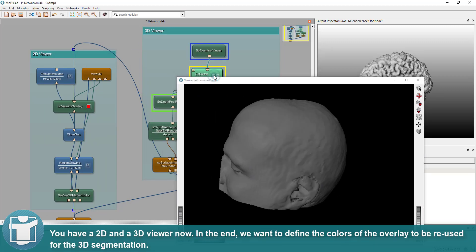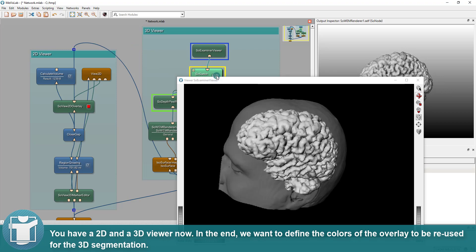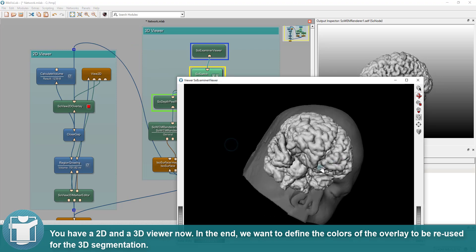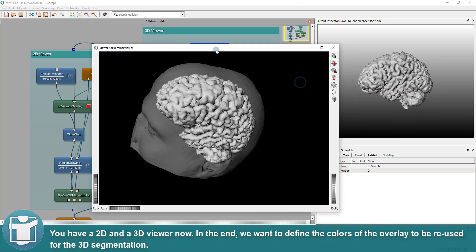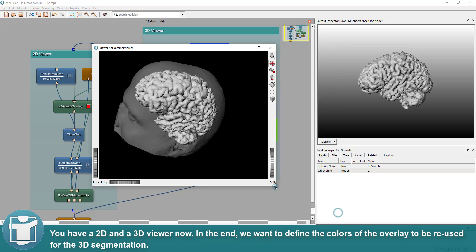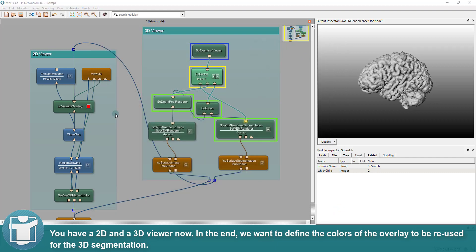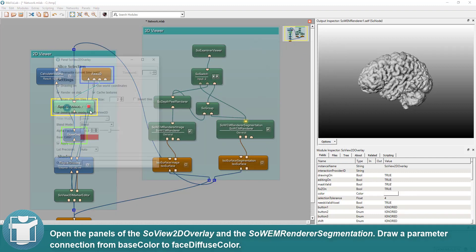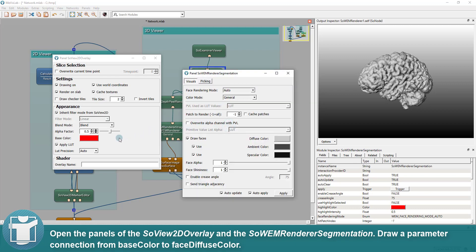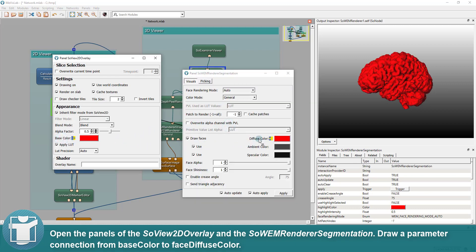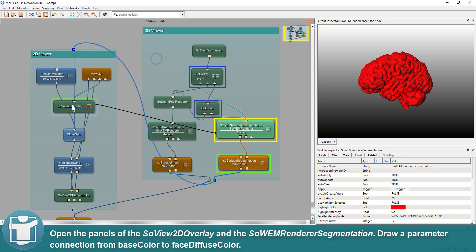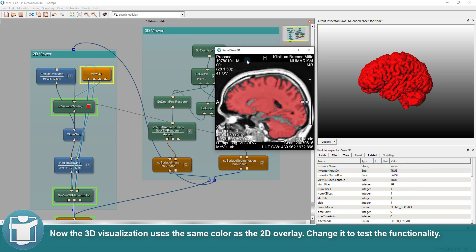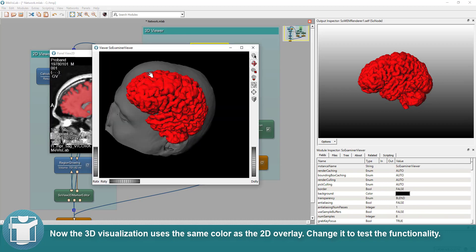You have a 2D and a 3D viewer now. In the end, we want to define the colors of the overlay to be reused for the 3D segmentation. Open the panels of the SoView2D overlay and the SoWEM renderer segmentation. Draw a parameter connection from SoView2D overlay base color to SoWEM renderer segmentation face diffuse color. Now the 3D visualization uses the same color as the 2D overlay.